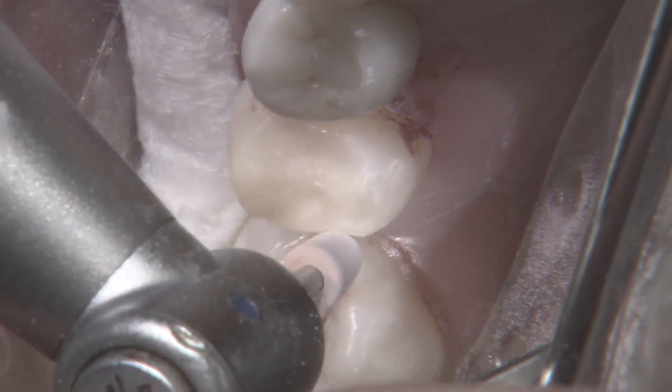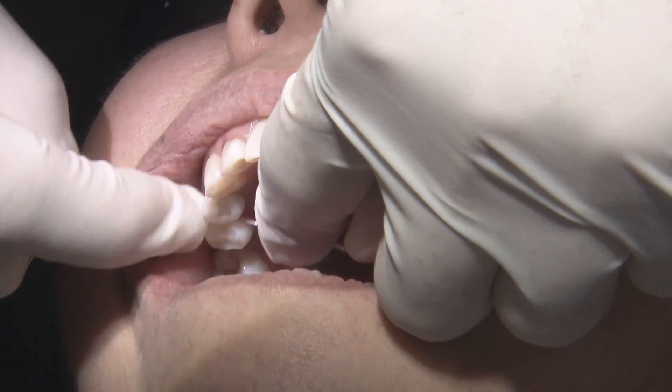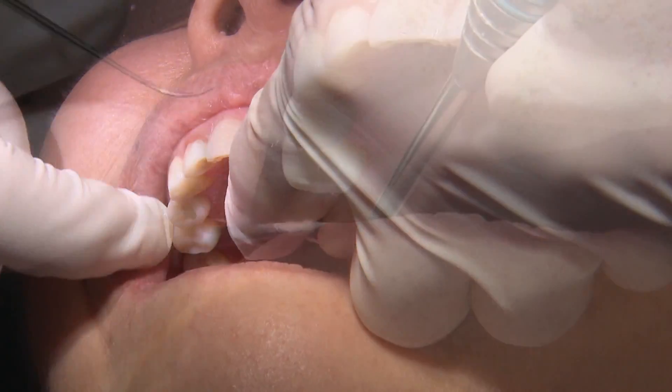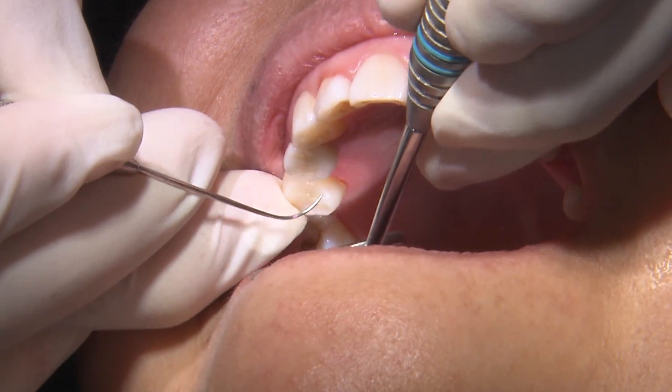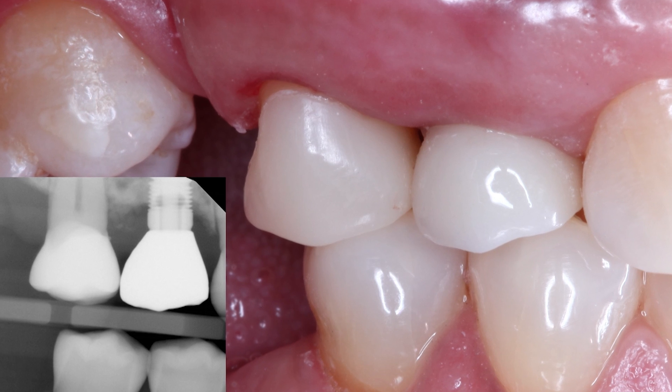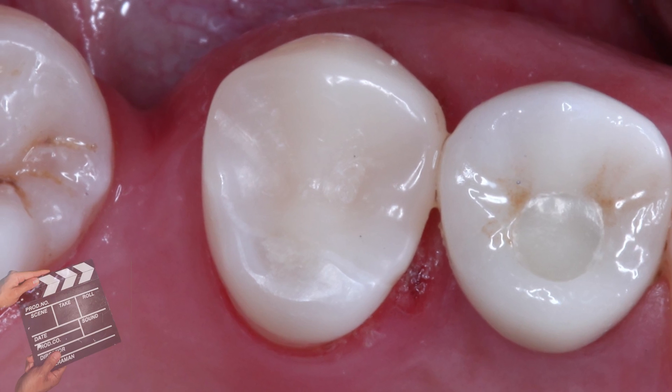In less than 15 minutes, we were able to scan, design, and mill this restoration using Camouflage Now. Offering these conservative restorations in a single appointment is very easy to do using the Glidewell.io chair-side solution, and should hopefully be a service all dentists can provide their patients in the future.